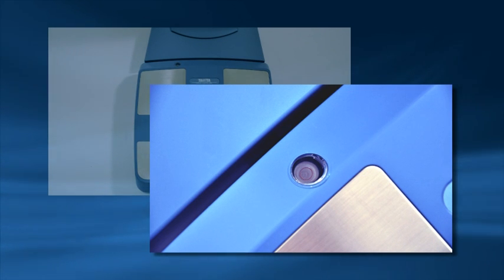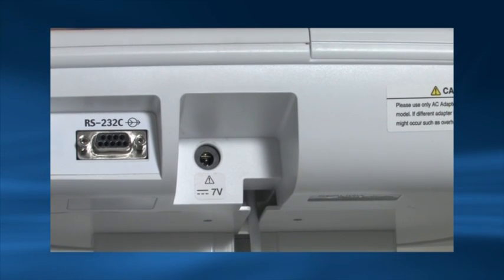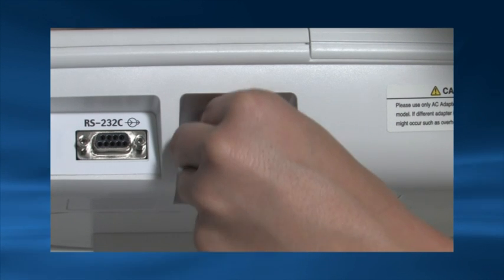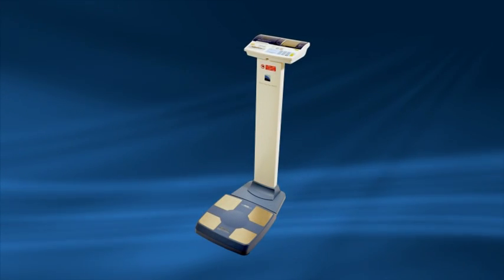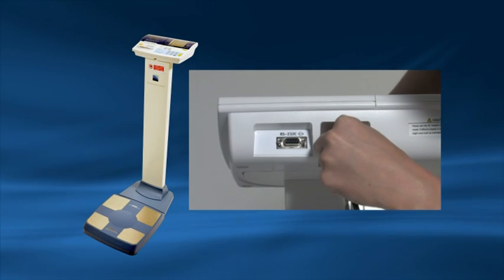Ensure the air bubble is centrally located. For the remote display version, simply insert the AC power cable into the back of the control box. Ensure only a Tanita AC cable is used. If you have purchased a column kit, you can mount the column, then insert the AC power cable to the back of the control box.